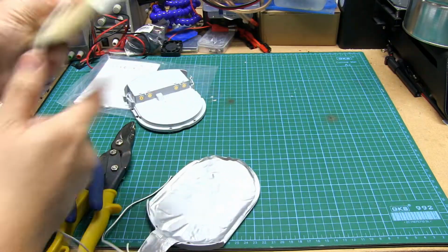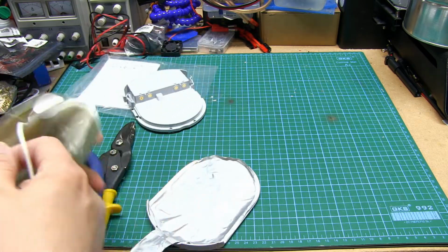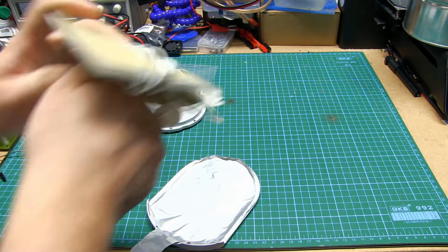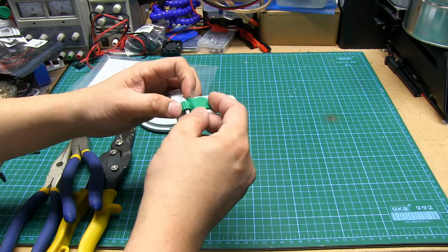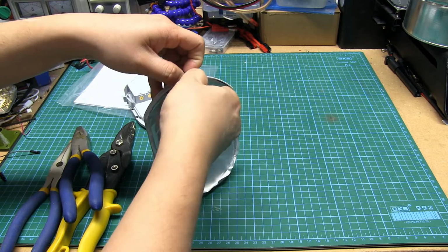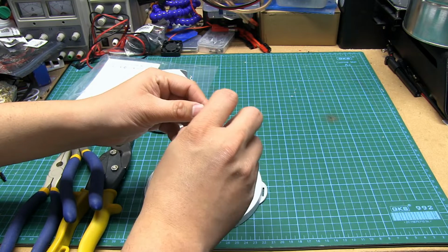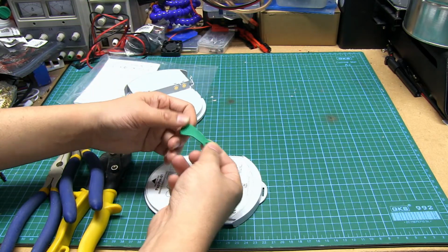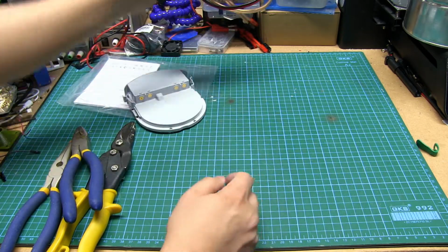This is garbage at this point. We've already taken a look at these pads before. Nothing spectacular, so go ahead and chuck these. And on the lid itself, this little rubber pull tab, I'm actually going to save that because these are useful. You can get fancy Hypalon pull tabs for zipper pulls, but this is free. I'll save it for a backpack or something, but that's garbage too.